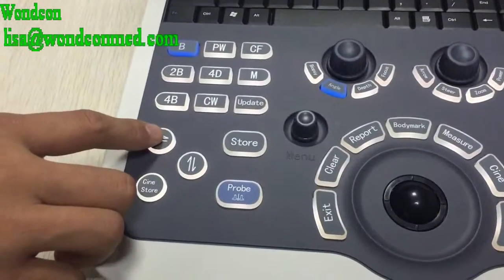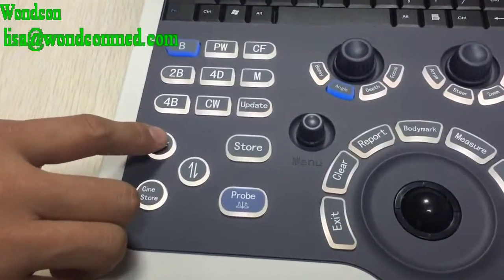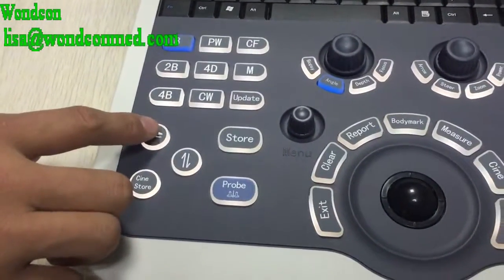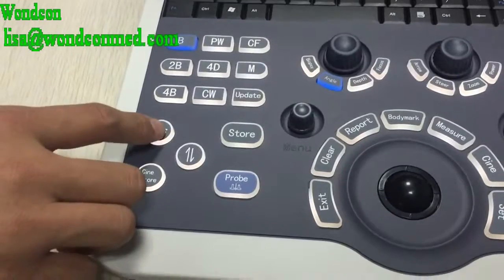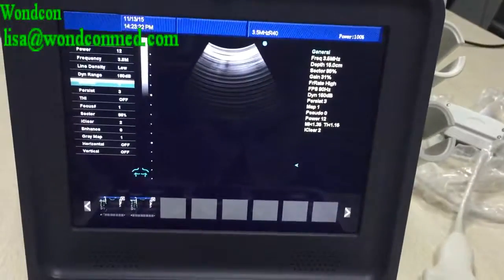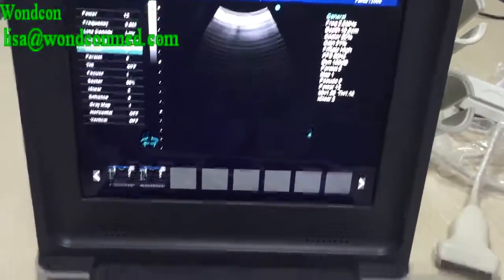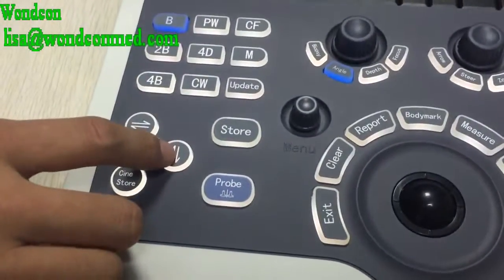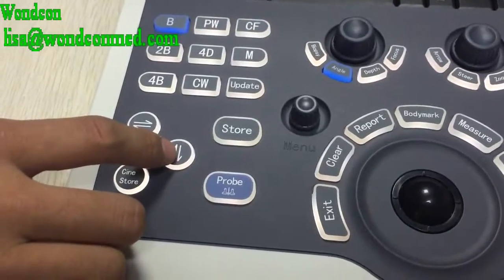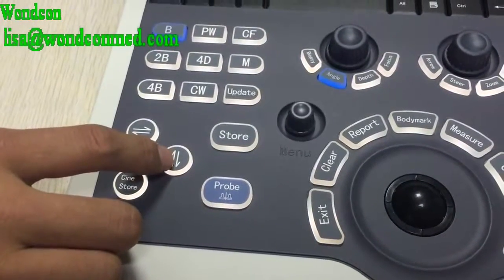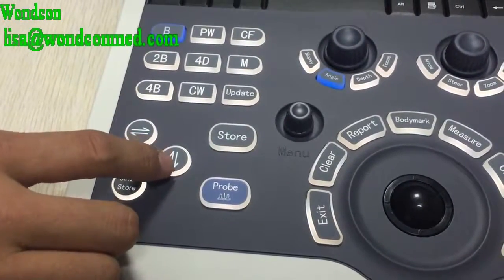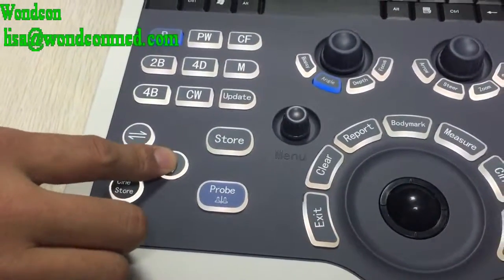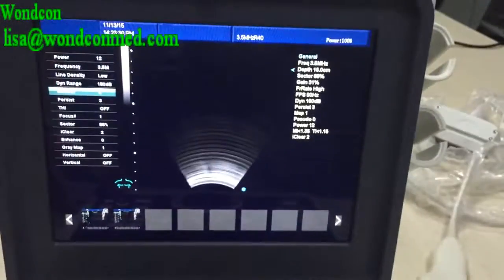This key is used to change the direction of images from left to right. This key is used to change the direction from up and down.